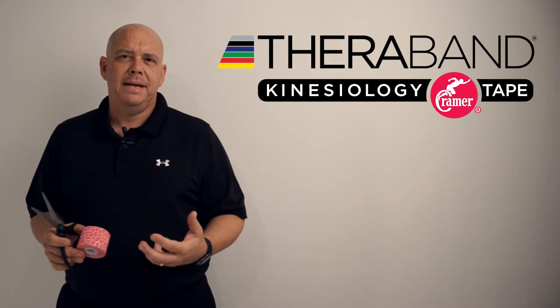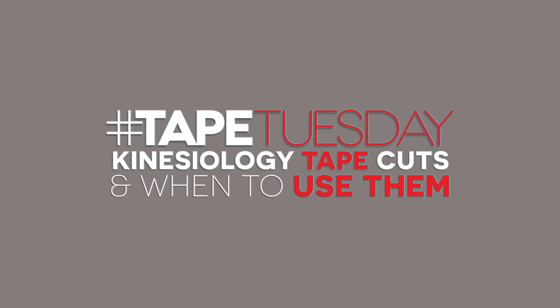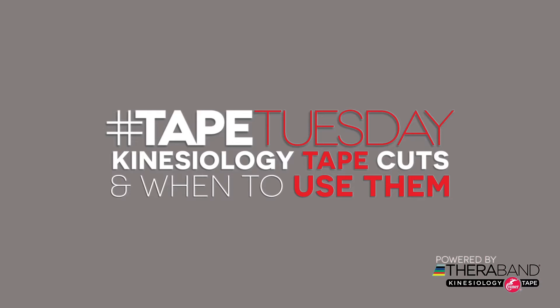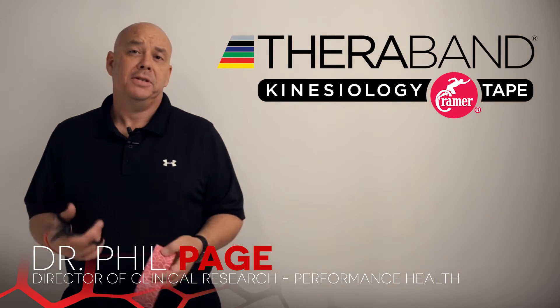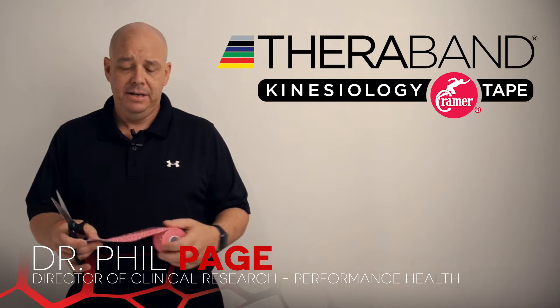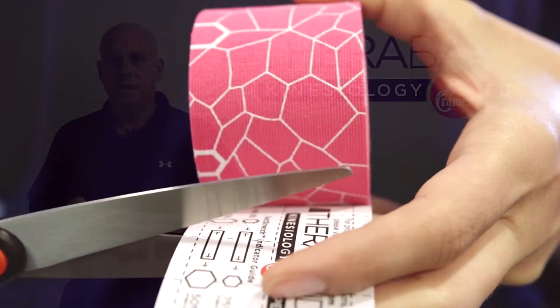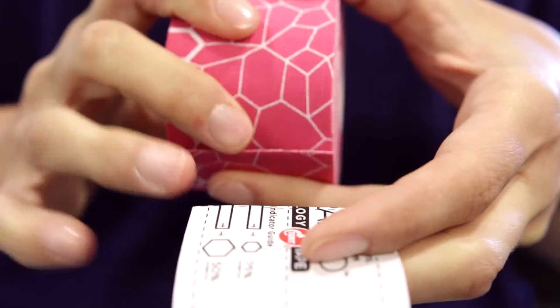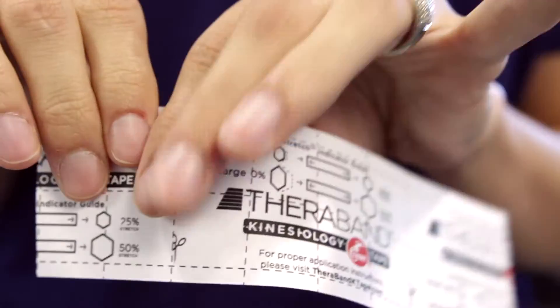I want to demonstrate three basic cuts of kinesiology tape. The first cut is the I cut — it looks like an eye, which is why they call it an I cut. You simply take off as much kinesiology tape from the roll as you need. The backing has little markers, and every mark indicates two centimeters, so you can cut it exactly where you need to.